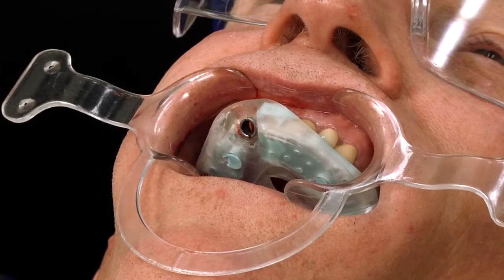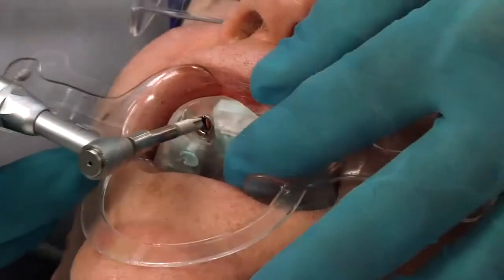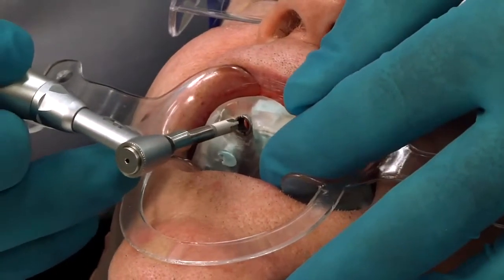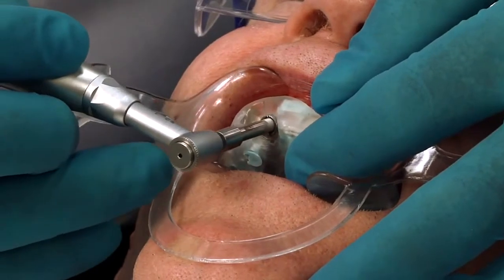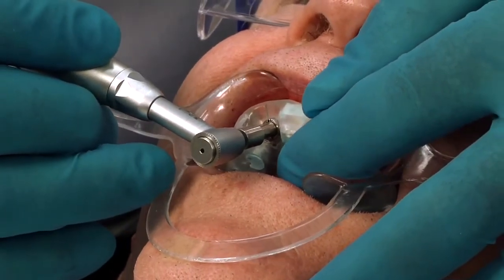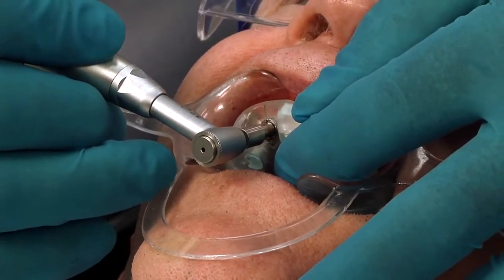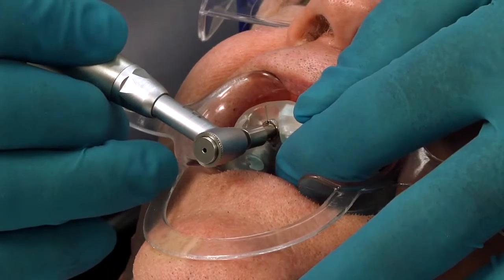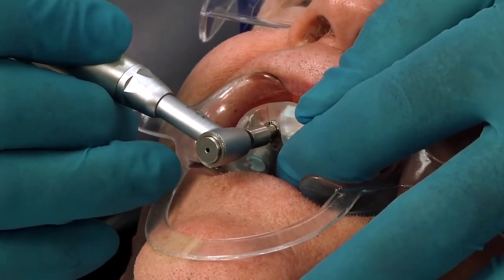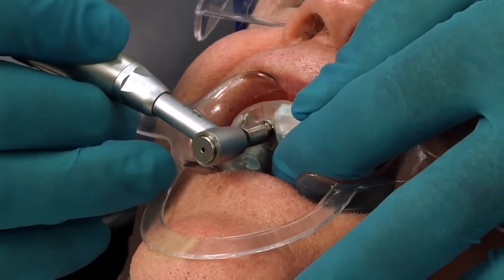We're going to put our torque at about 25, so that it'll torque out when we hit 25 Newton centimeters. And now we'll literally just place the implant right through the guide, just like so. And you can hear it engaging into the bone — just light pressure. As I push down, you can see how we're going a little farther in.